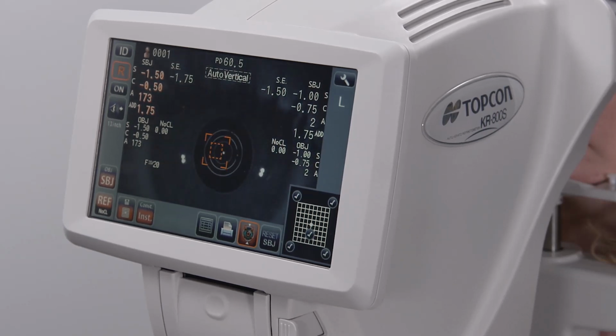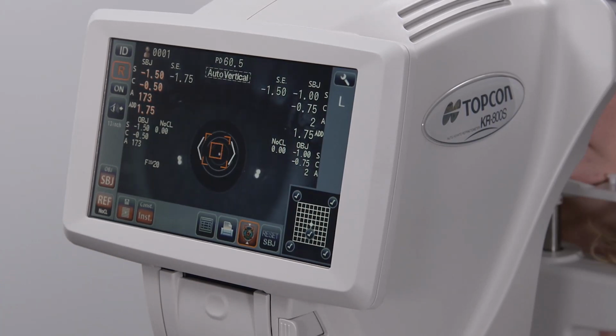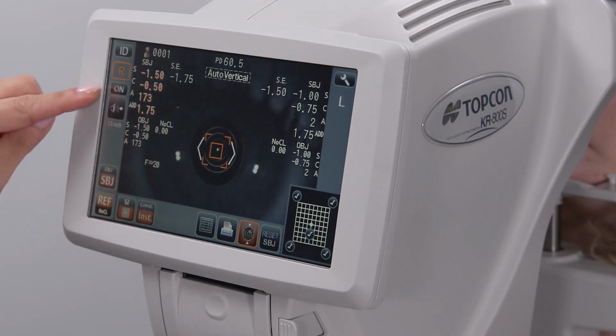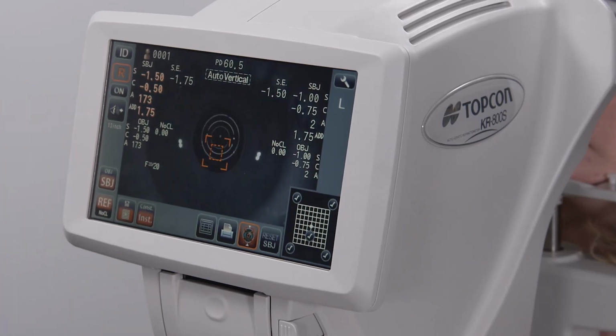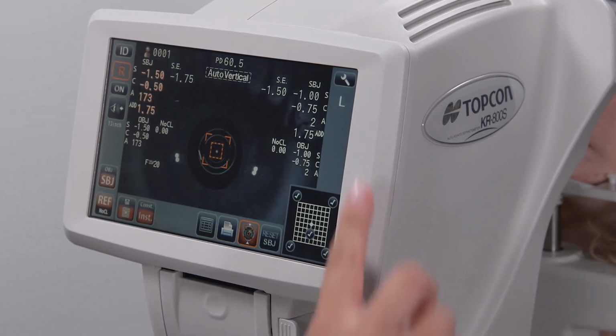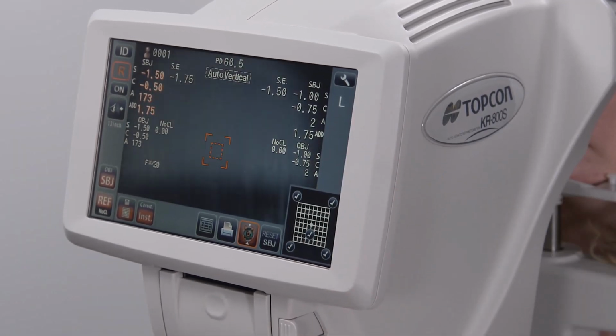If you wish to have the grid displayed for only an instant, make sure this icon says Inst. Explain to the patient that a grid will appear for just a moment and have them tell you if they notice any distortion in the pattern. Then use the on icon near the upper left to activate the grid image. Once activated, the grid will vanish again quickly. Select the other eye and repeat these steps to determine and record any grid distortions for that eye.